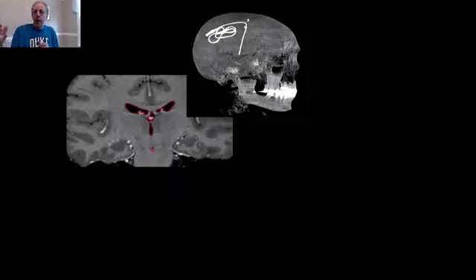Then at the end, the neurosurgeon did a lot of planning and says, okay, this is my target because you help me localize it, you help me figure out the connections. After surgery, the subject goes into a CT and we take a picture of this, which is the cable that is going to the chest for the battery, and this is the electrode that was inserted.